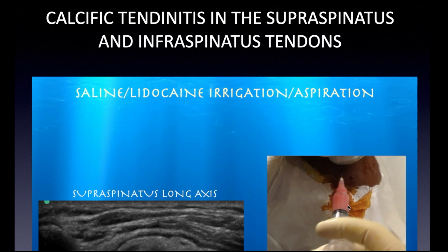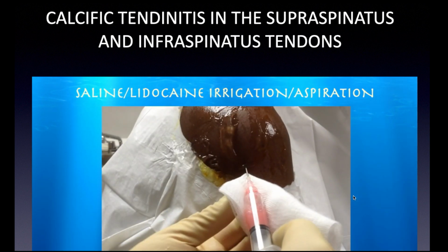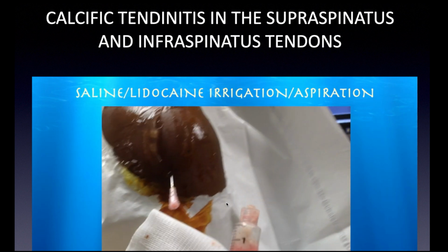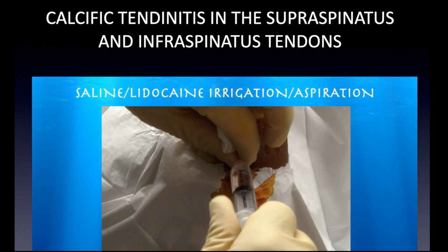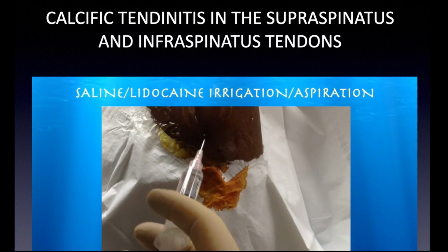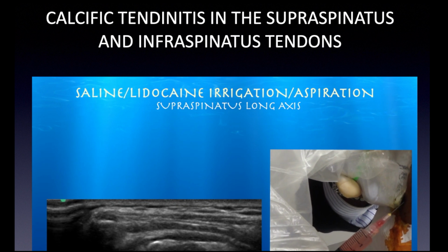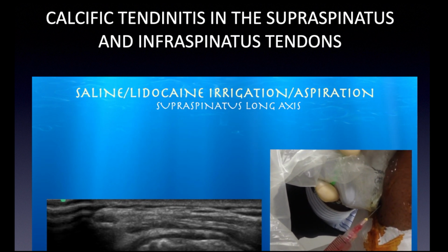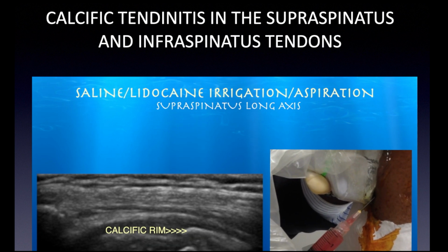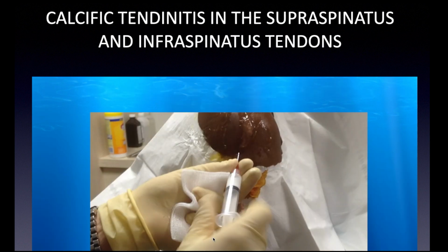It may get a little bloody because you're going through tendon and whatnot. And you want to use a sterile gauze pad to change the needle, because you can be touching the needle with the gauze pad. And then you just go through a bunch of rounds of these. If you do have an assistant, that's very helpful. I don't think I've ever done this by myself. I've always had a medical assistant hand me things because you are going through a lot of syringes. And it's almost like a fish mouth we create. It just pulls up and closes.